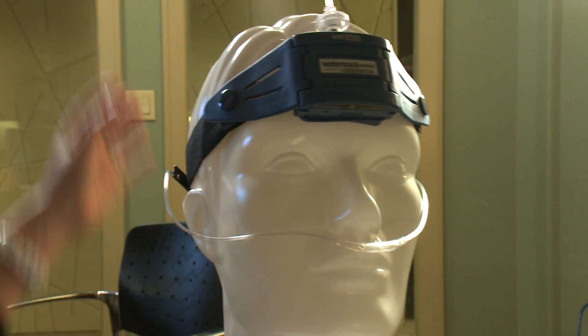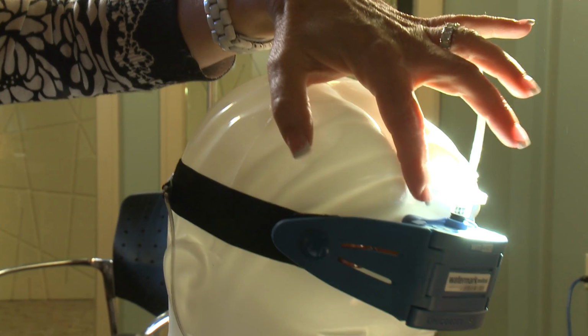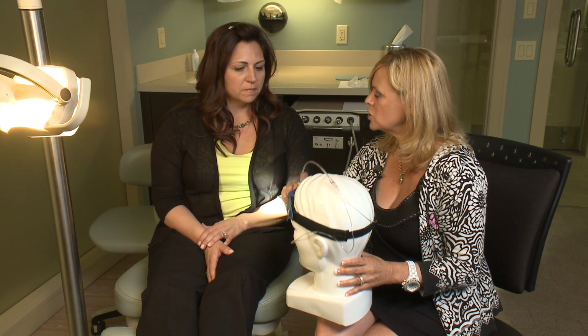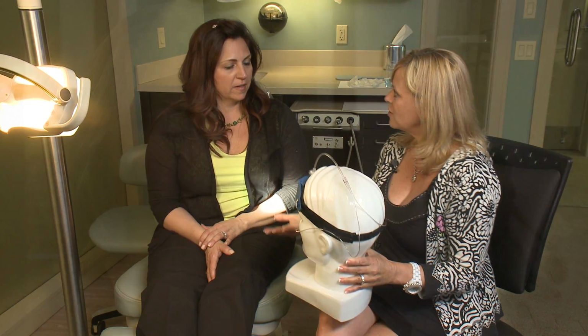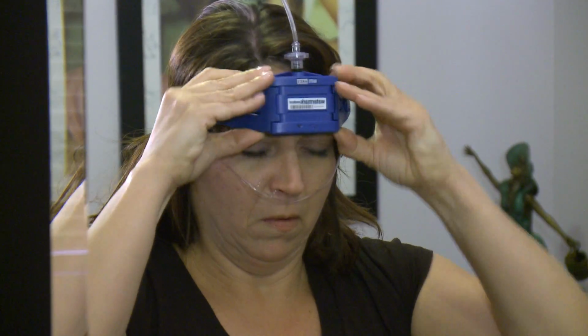So basically, you get this fitted to your head, you take it home, and you just go to bed in your own home. Absolutely. You come into the office, a device is fitted to your head, and you hook it on, and it's as simple as turning it on, and then you basically go home, just go to bed at night, come back the next day, drop it off.